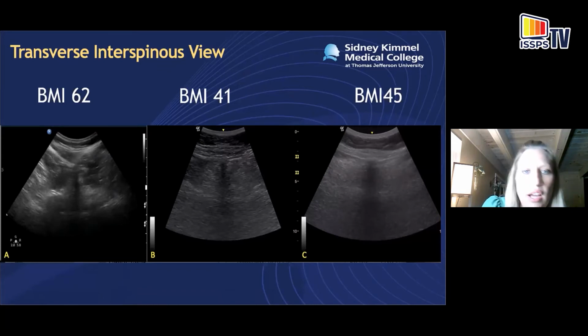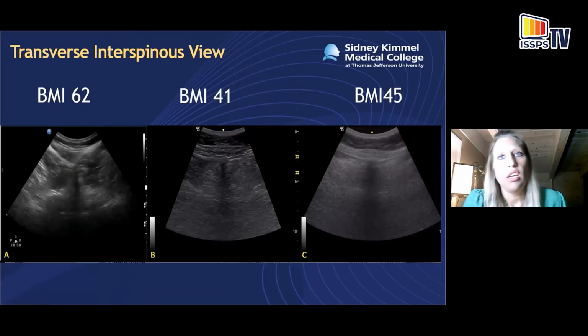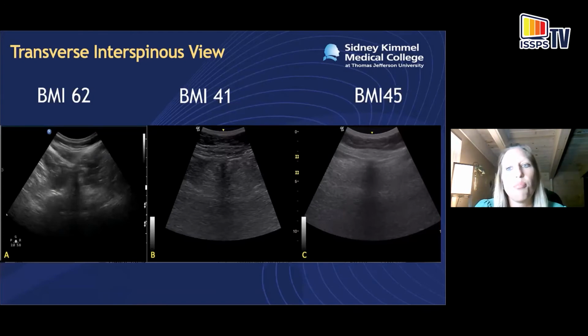So while usually the higher BMI will account for lower image quality, in general, you're going to see that as you get higher, the image quality is going to degrade compared to a non-obese patient. But a lot of times you'll be able to see some really great images in obese patients. So it's somewhat unpredictable sometimes.